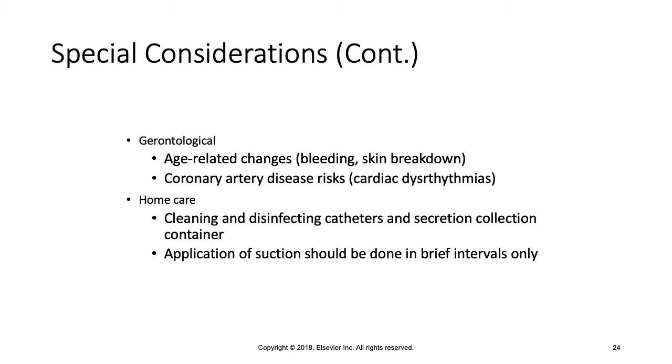For the gerontological population, just be aware of some of the possible age-related changes that you can see. The capillaries are more fragile, so they're more likely to have bleeding. So suction pressures may have to be less. There's a chance for skin breakdown because the skin is fragile, so the area around the stoma needs to be assessed very carefully.